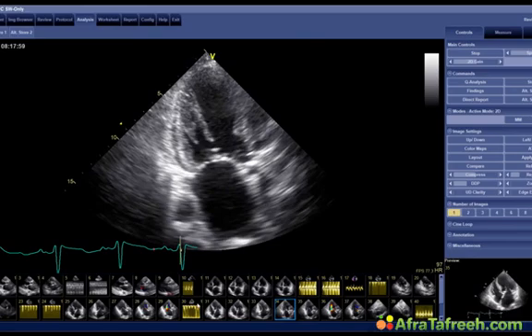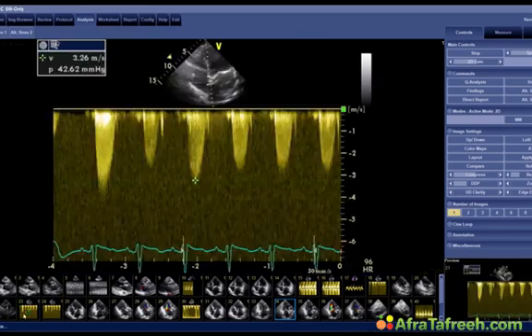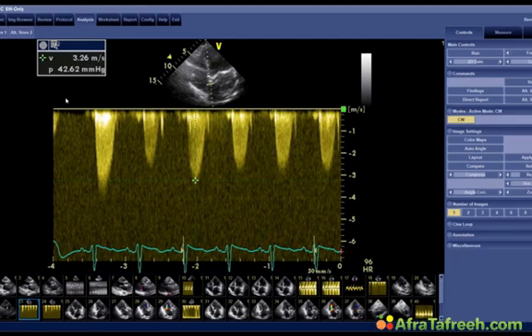Poor left ventricular function. And how do you think the gradients are? Well, lower. Surprising? Not really. It's obvious that now she has less flow across the aortic valve because her left ventricular function is now deteriorated, and therefore we have a situation which we could actually call low flow, low gradient aortic stenosis, but a situation where we are quite certain that it is true low flow, low gradient aortic stenosis.